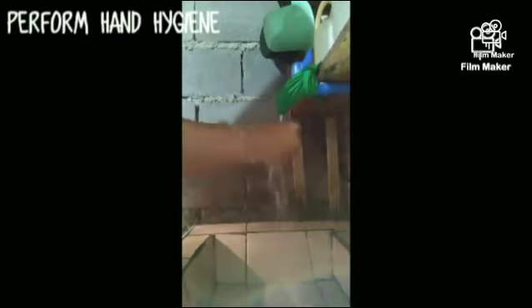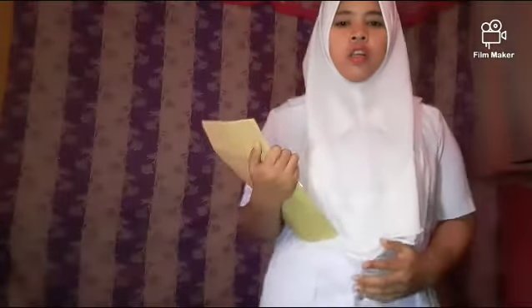Check the order on the client chart. The rationale for this is removal of a urinary catheter is only done with a medical order. Performing hand washing is done to prevent the spreading of microorganisms. Then, with a ticket, call out the client's name, check the identification band, and explain the procedure to ensure the right client and elicit cooperation.